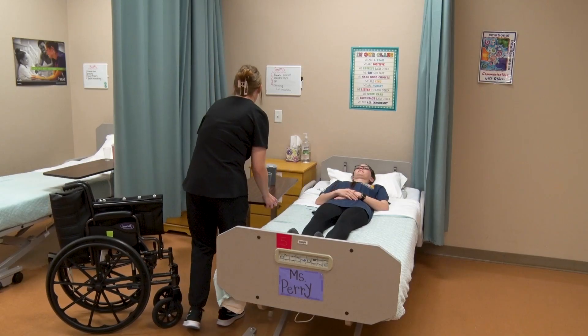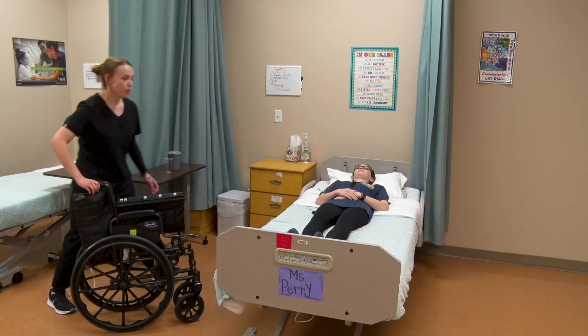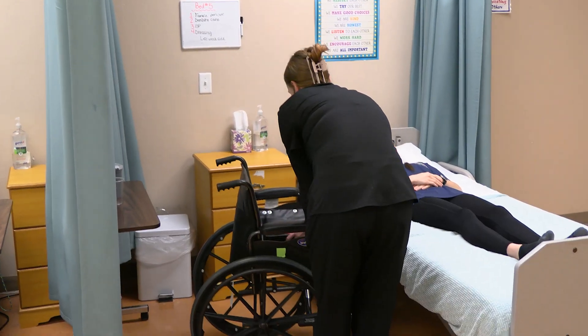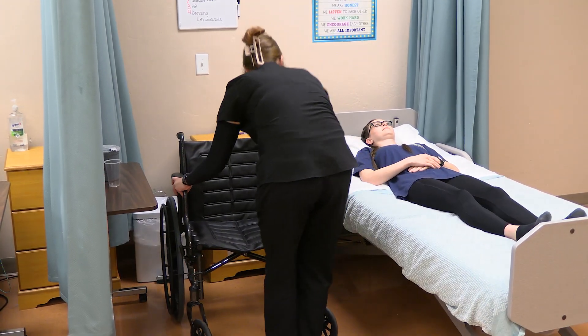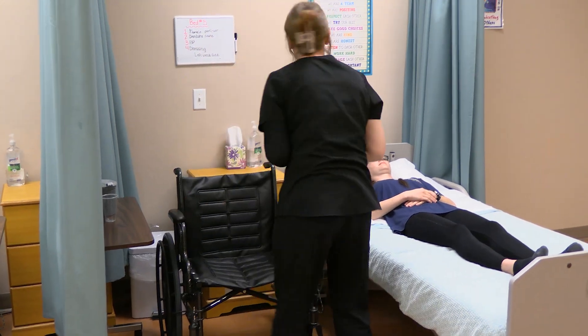Hi, Ms. Sophia. I am back with your wheelchair. I'm going to set that up first and then I'm going to get the walker, the gait belt, and your slippers. I'm locking my wheelchair brakes and I'll be right back.